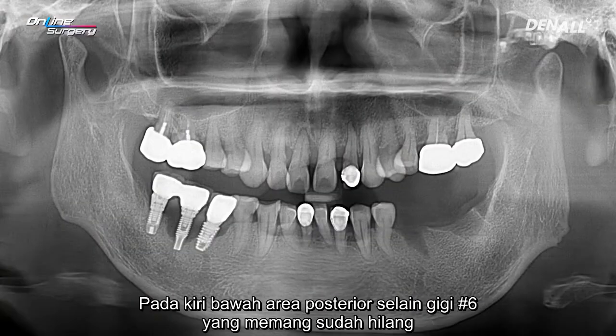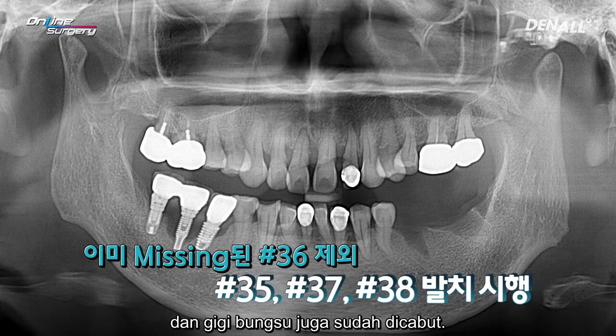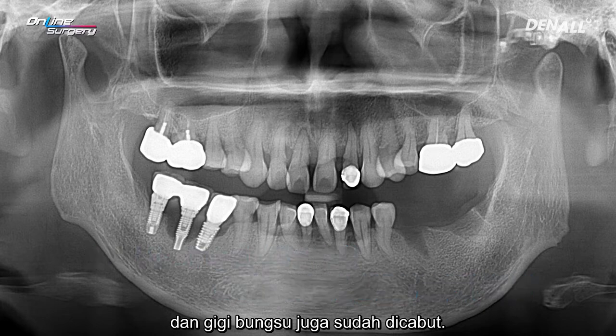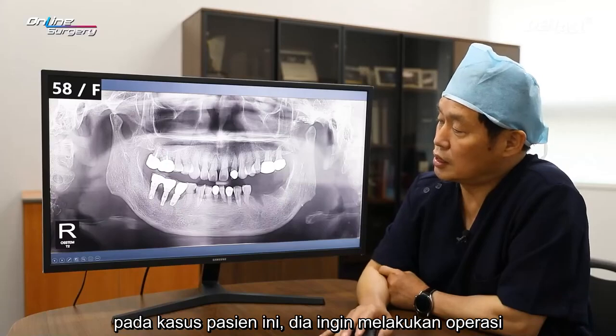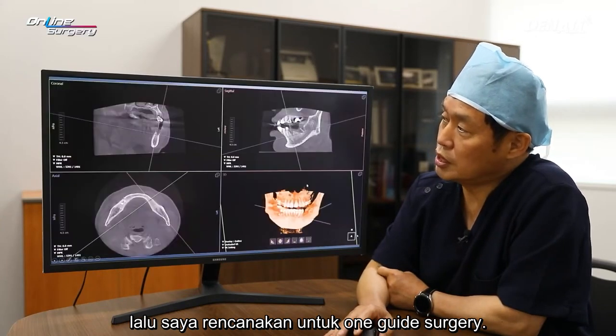In the lower left posterior area, apart from number 6, which was already missing, number 5, number 7, which was tilted, and the wisdom tooth were extracted. And in the case of this patient, she wanted surgery, and I planned for OneGuide surgery.